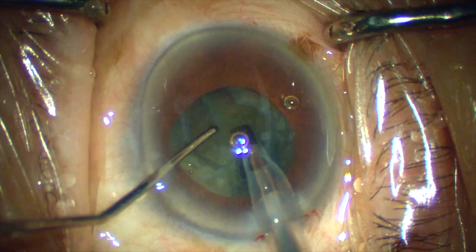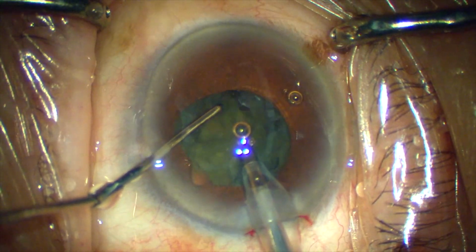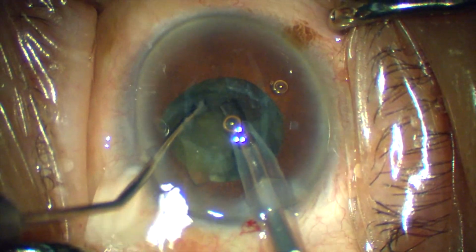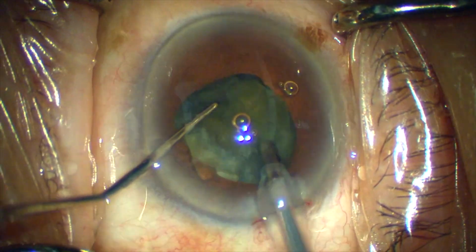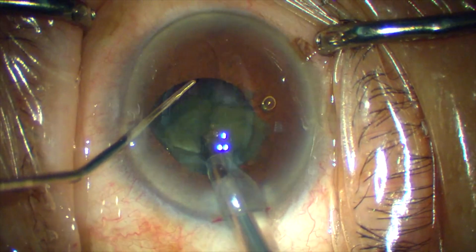The most common cause of failure in lens dividing is mistakes in approaching the adequate depth of the lens. This new chopper helps more successful lens dividing with the same technique you are using. I hope this new instrument is helpful.